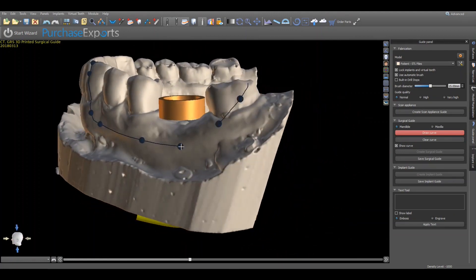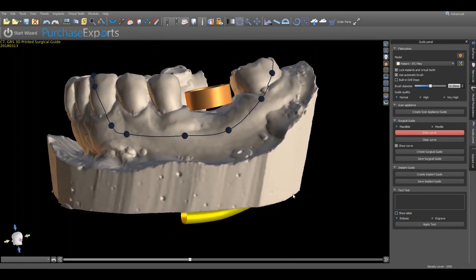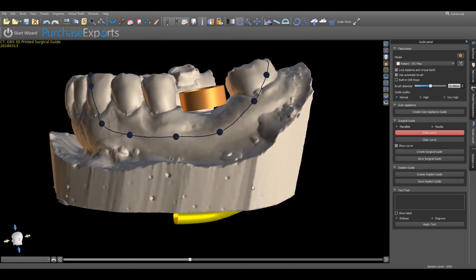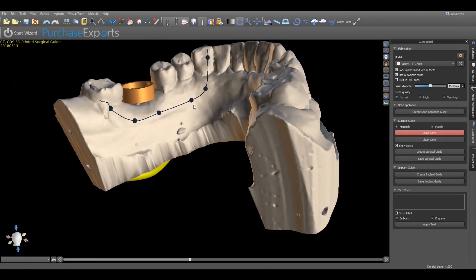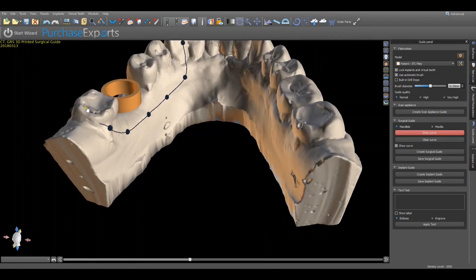If any adjustments are needed, simply place the cursor on the node to be adjusted and by clicking and holding the left mouse button, reposition each node into the desired location. If an entirely new design is required, click on clear curve under the surgical guide submenu.